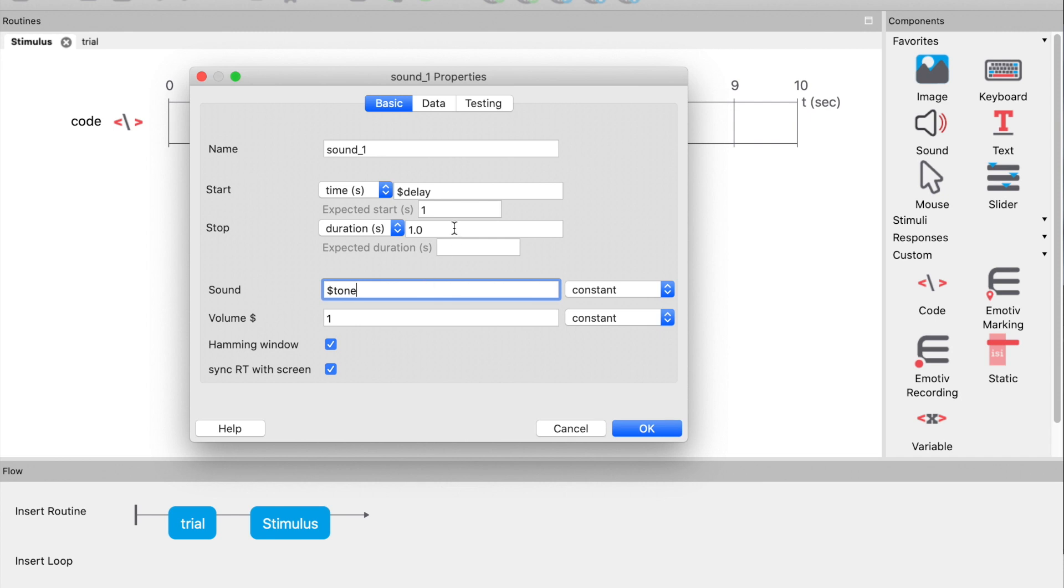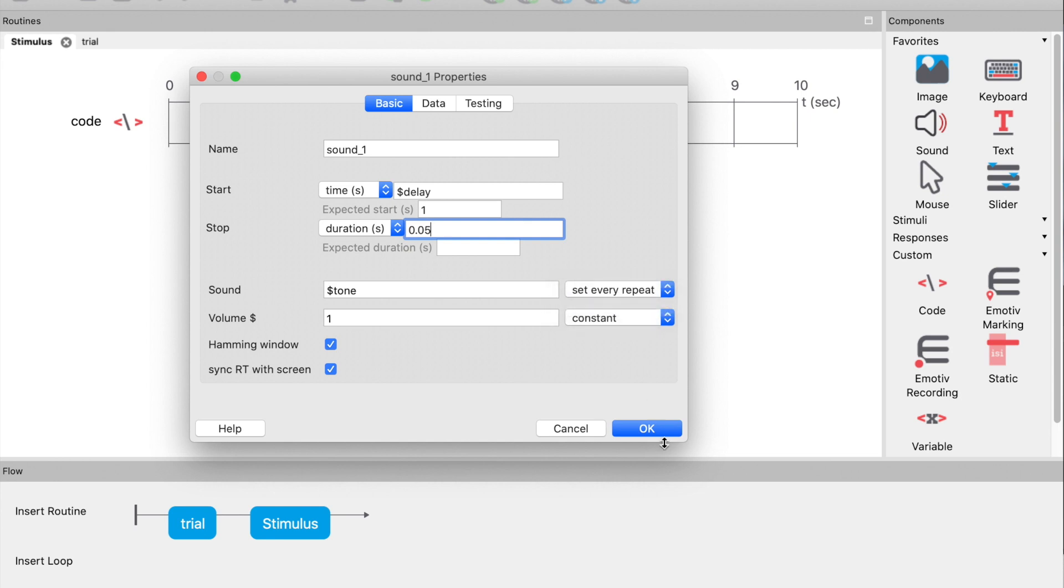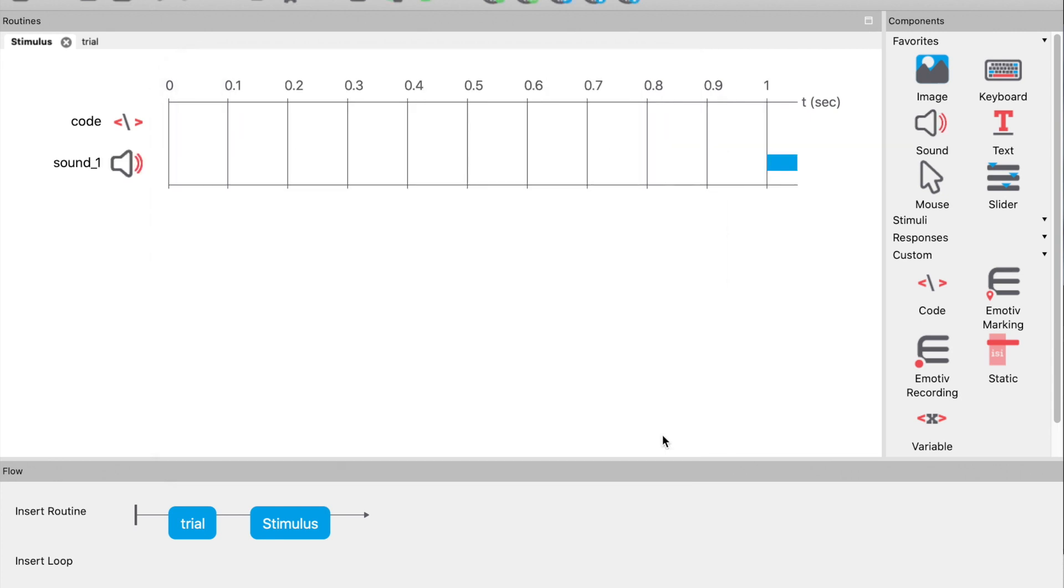Now set the duration to 0.05 seconds. We also have to change the selector from constant to set every repeat.